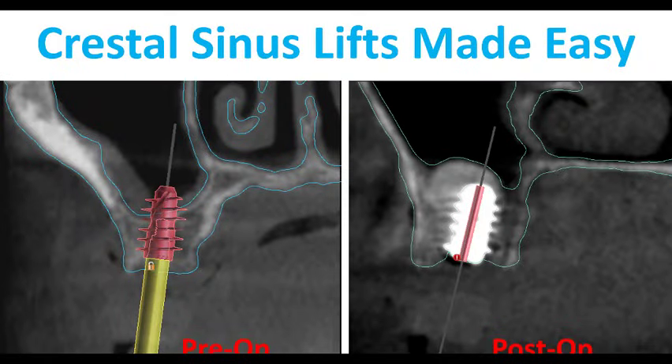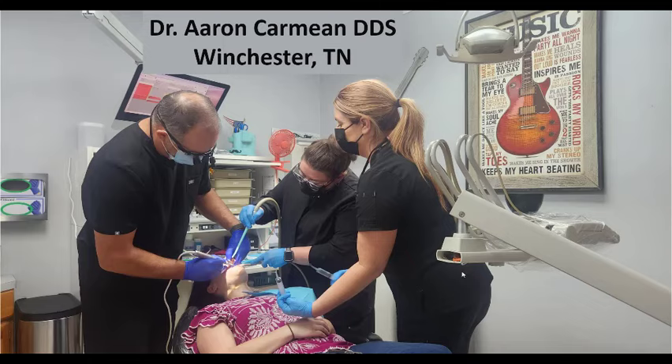Hey, what's up everyone? It's Gory Glenn and I'm going to be talking about sinus lifts today. I'll be showing the Crestal Sinus Lift Kit, the fully guided sinus lift kit that Blue Sky Bio sells. This is a case we did this past week. I went in and helped Dr. Aaron Carmean, who's a good friend of mine and a dentist here in town. We're doing a full arch on this individual and both of the molar sites, the sinus was kind of low. So we just did some simple sinus elevations, did an excellent job. I'm a huge fan of this kit.